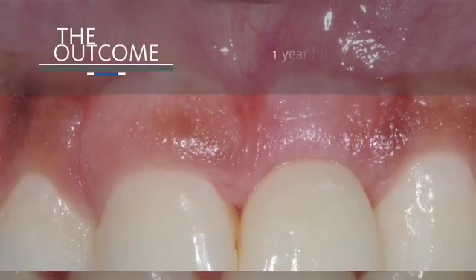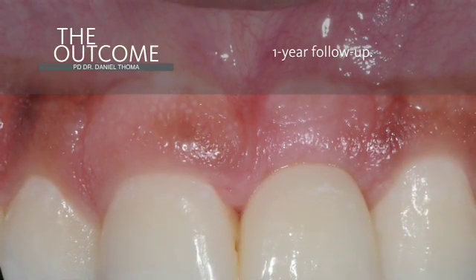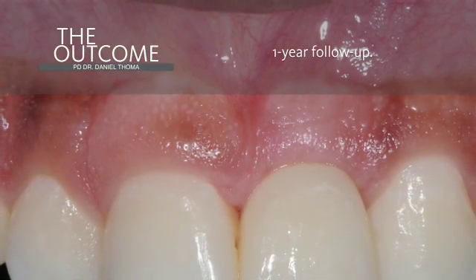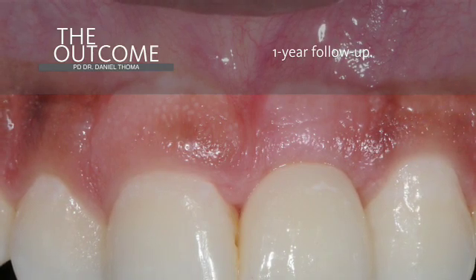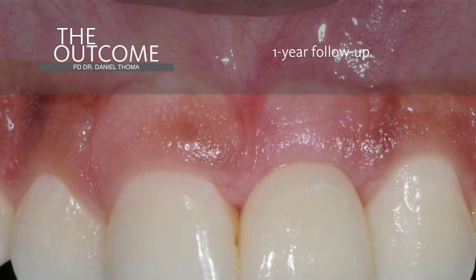The final view one year after the insertion of the final reconstruction shows very pleasing aesthetic outcomes. The patient is happy, the peri-implant tissues are healthy, and no bleeding on probing can be observed.